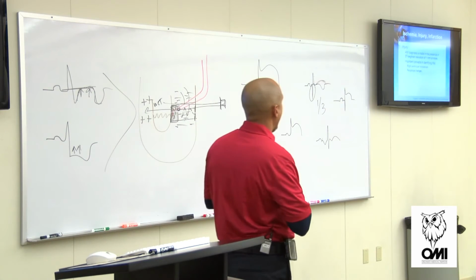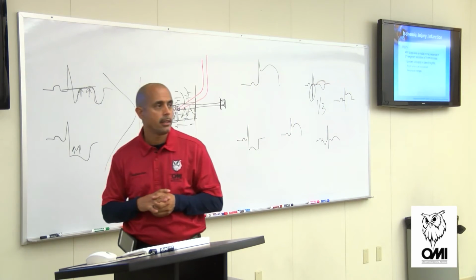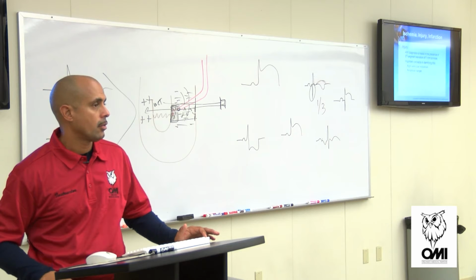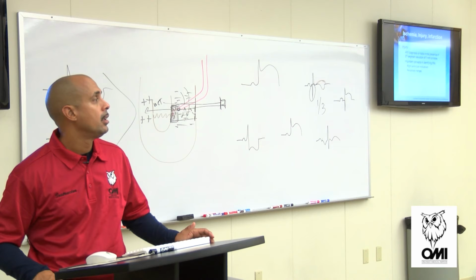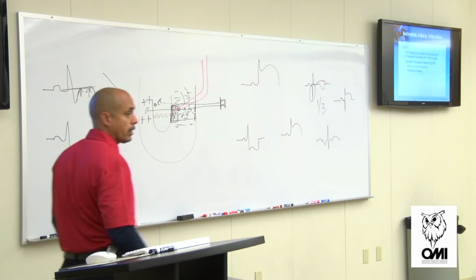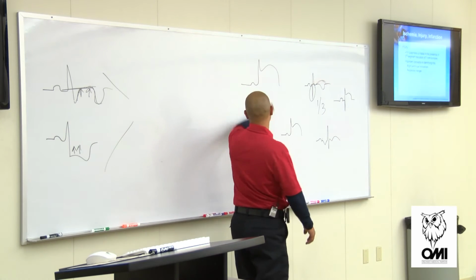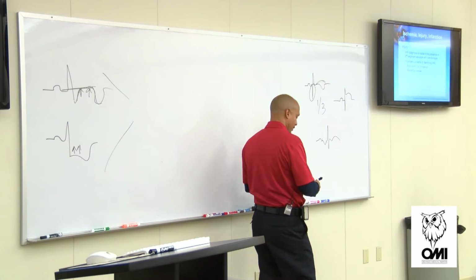Very good. Now, we have what's called reciprocal changes. Anybody know what reciprocal changes are? Who can tell me? Well, we don't move any leads, but you're kind of on track. You're going to see the opposite deflection. I know you were en route there, just need a little help. No biggie.